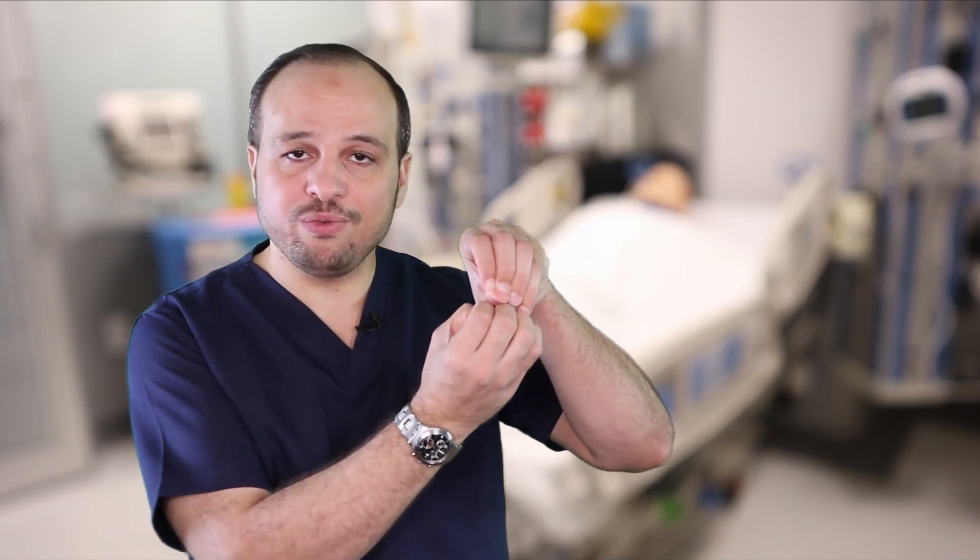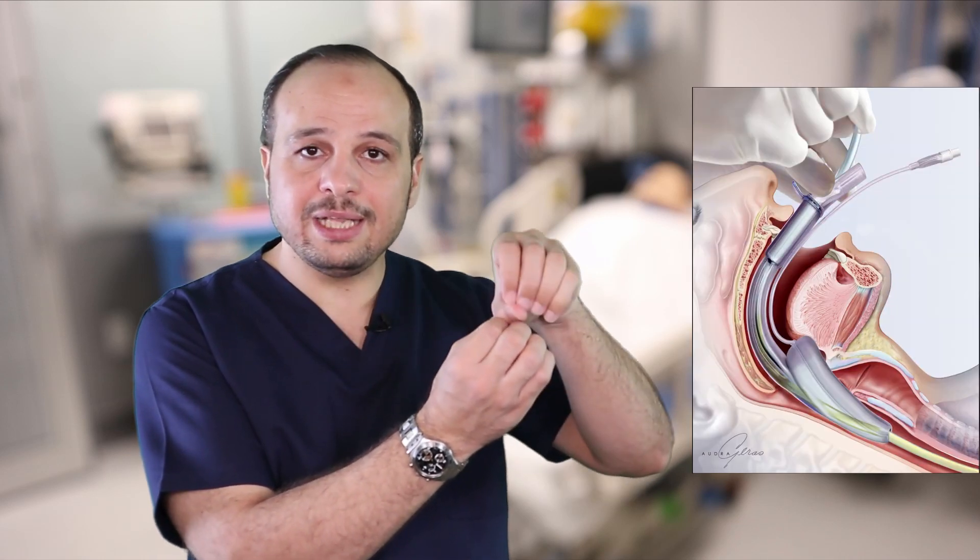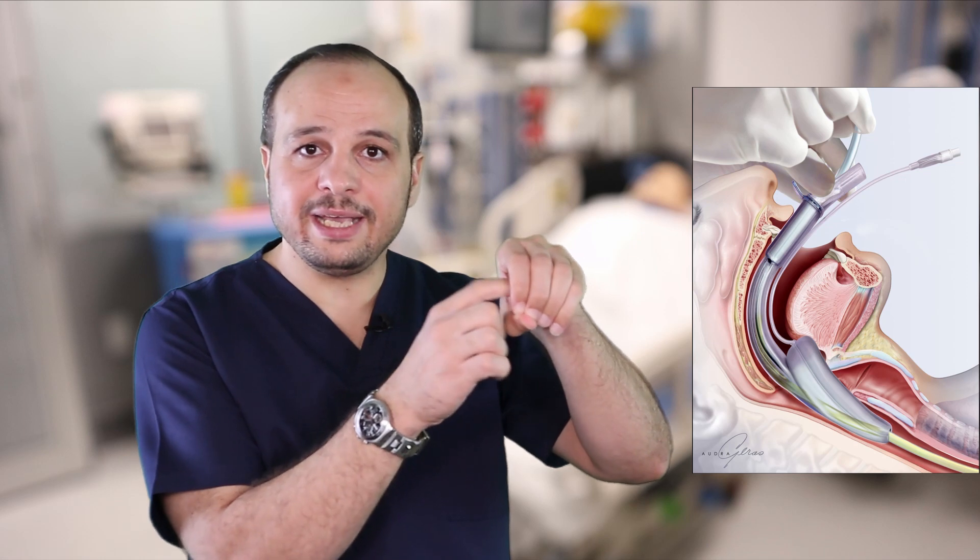The main idea is to block the esophagus and to give air to the trachea. Here we have the trachea, and behind the trachea we have the esophagus. The LMA will come and fix here — it will close the esophagus and remain open to the trachea, so it will deliver air to the trachea. Comparing with the ETT, the LMA is easier to insert.